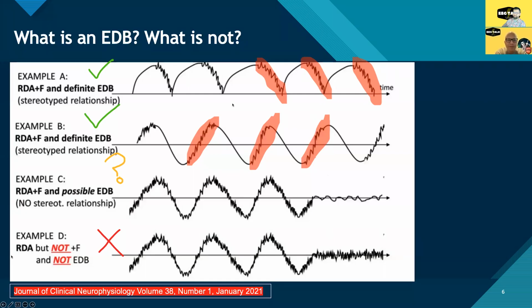Famous EEGs. That's right, extreme delta brush. Yeah, they're pretty extreme. So that's the first point. Right, they live on the edge. Yeah. And I'll take the first big concept, and then I'll let you explain the more difficult one.